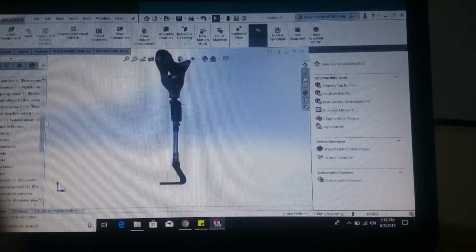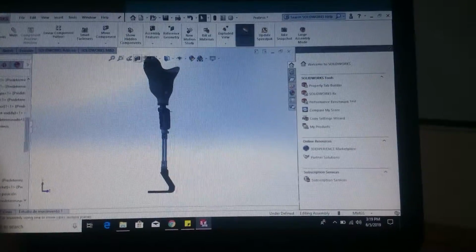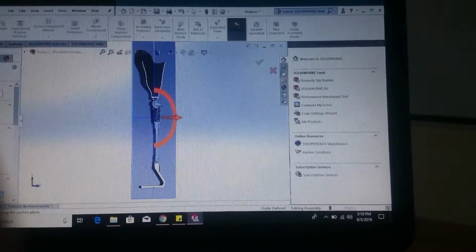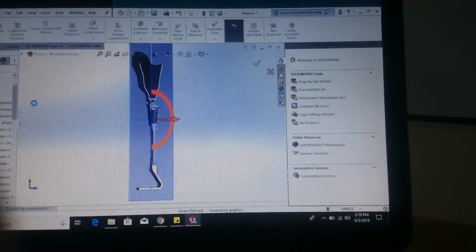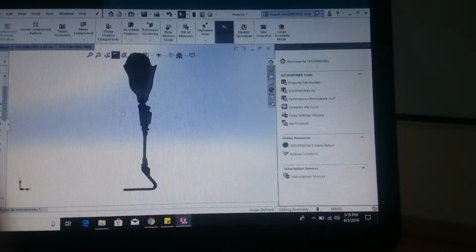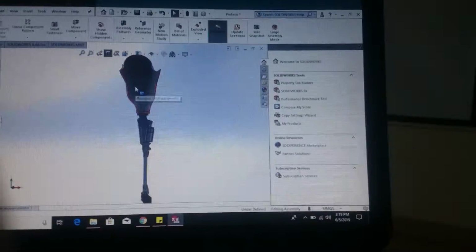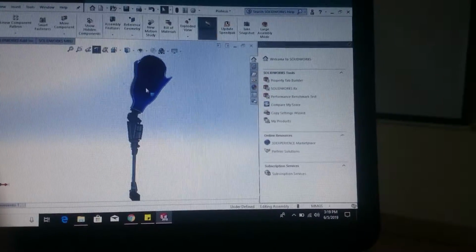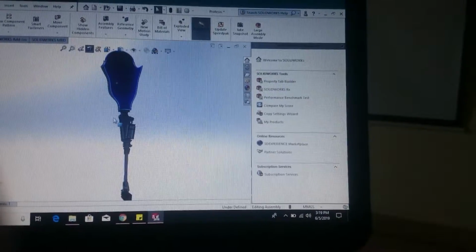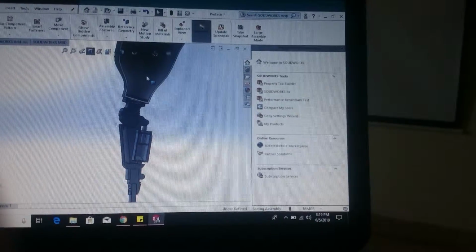Amputations above the knee. Amputations above the knee can occur for different reasons, and therefore the indication and the behavior to follow must be different. In patients with normal high activity levels, the knee joint is free, with greater freedom of movement and the correct extension and flexion of the limb.